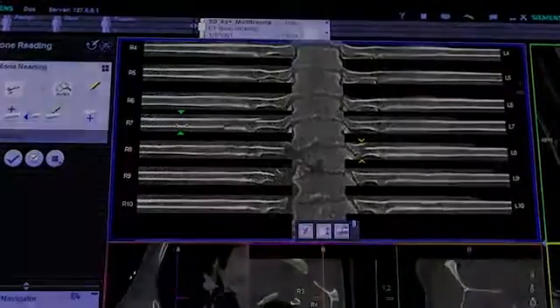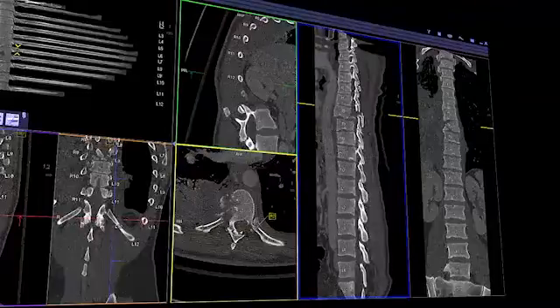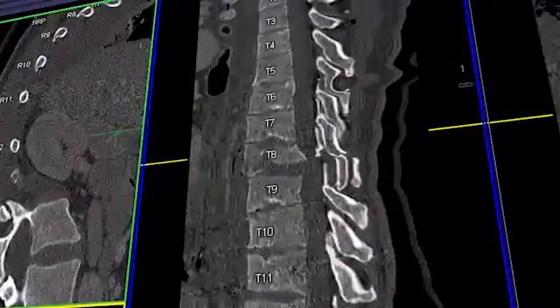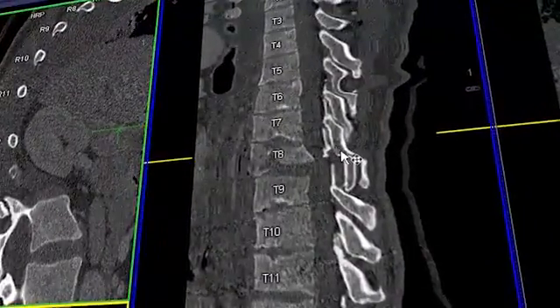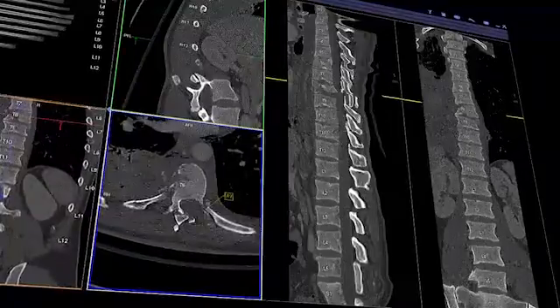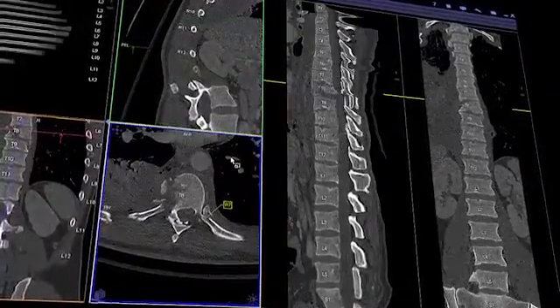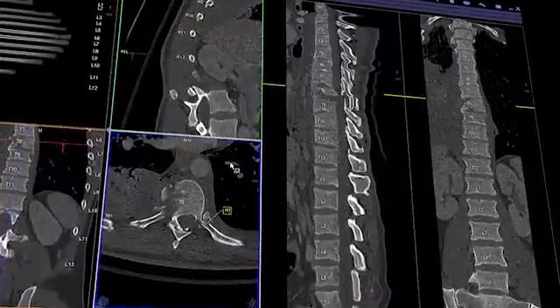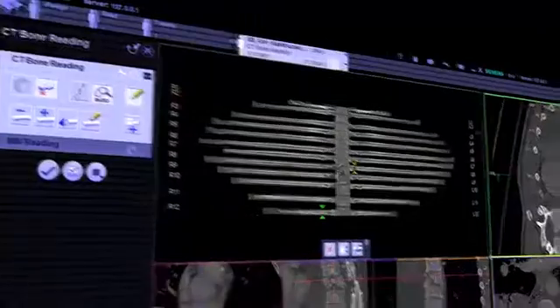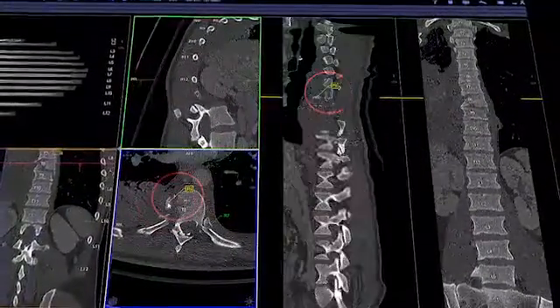Let's move over to the second part of the screen. Due to the stretched view of the spine, the fracture of vertebral body T8 can be recognized right away. Evidently, the spinal cord is affected as well. Orthogonal to the stretched view, the system provides you with cross sections. As you scroll through them, the position along the spine is also updated in real time. Again, a review marker may be set to bring attention to this injury in your final report.